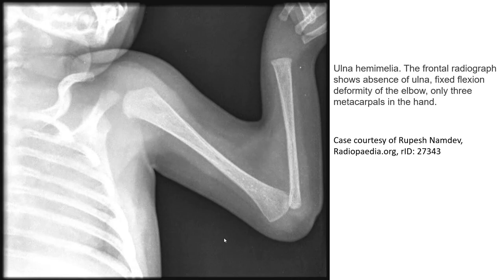This is an example of ulnar hemimelia on a frontal radiograph, showing absence of the ulna, fixed flexion deformity of the elbow, and only three metacarpals in the hand.